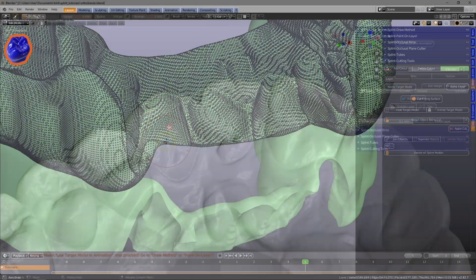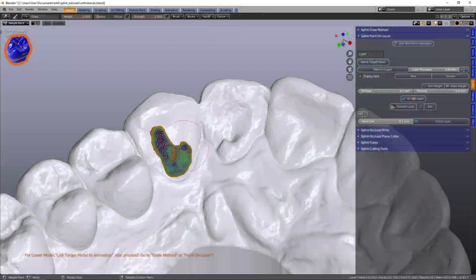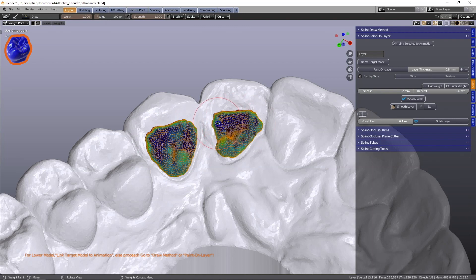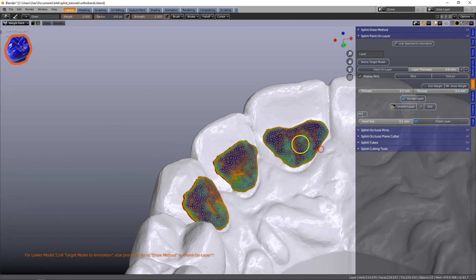Extend your Blender knowledge with some of the additional features included in the Splint Designer module.